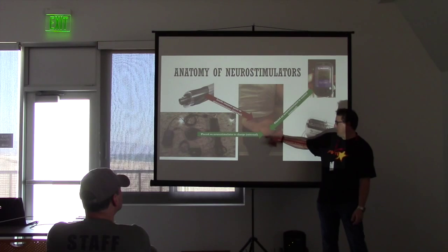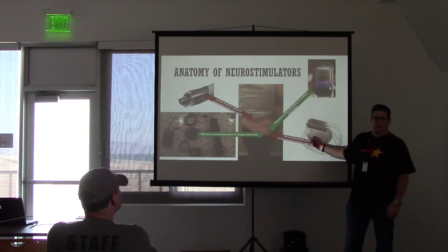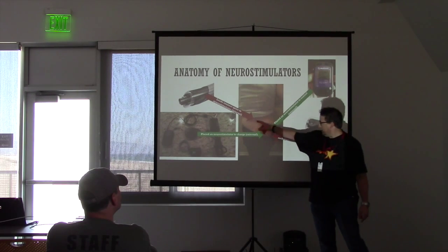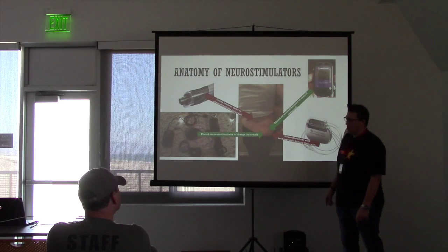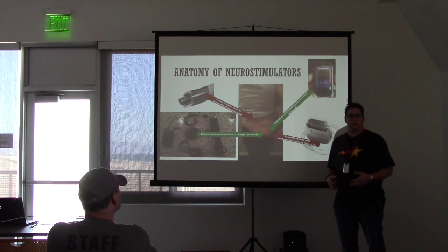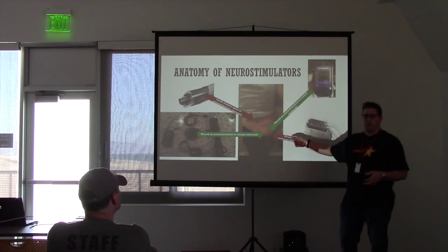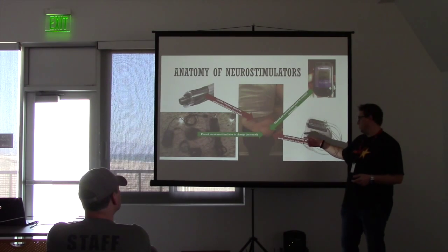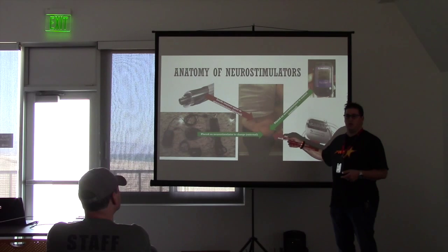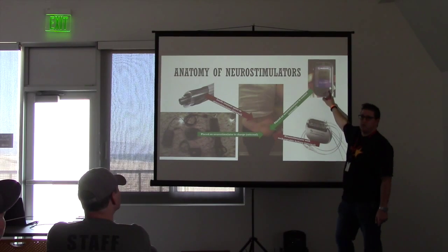Contrast is a little weird. There's a 3-inch incision here, right below her waistline. That's where this pain management device is installed. And there's a 1.5-inch cut here into her spine, and that's where the leads actually go in. So unlike some of the other medical devices where researchers say, you know what, if it's vulnerable, take it out, we're talking about an operation at this point. It's tied into her spine, there's anchors, and the initial operation costs $30,000. So that's not something that we're going to just go, hey, why not? Let's just update it.